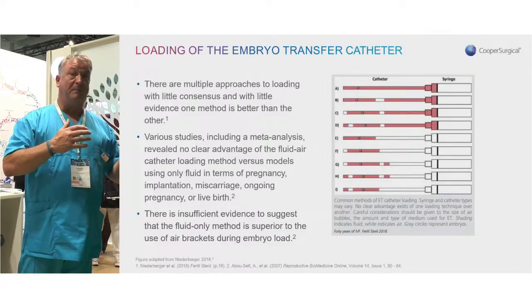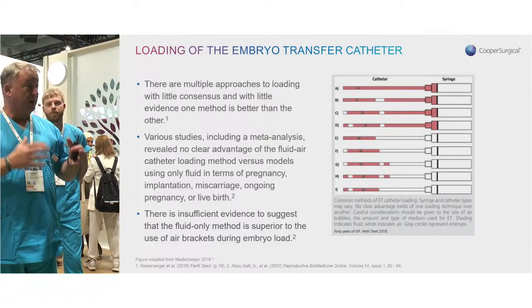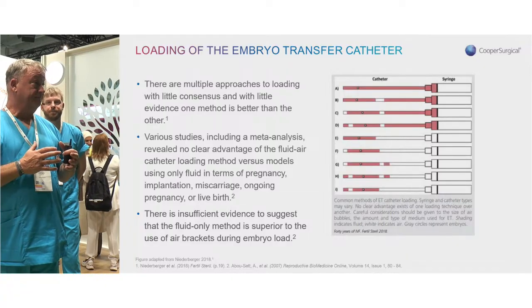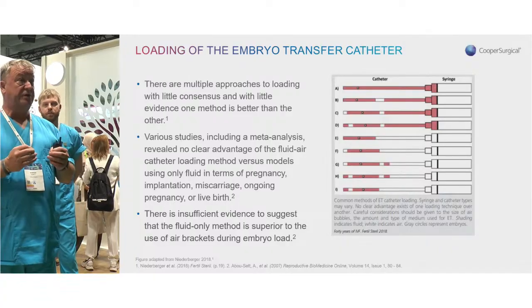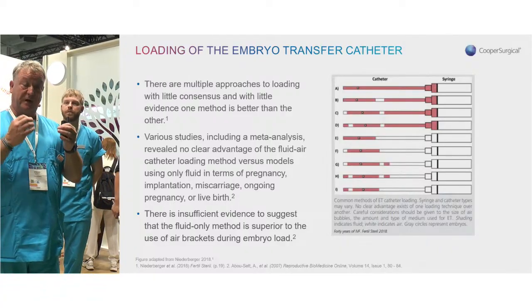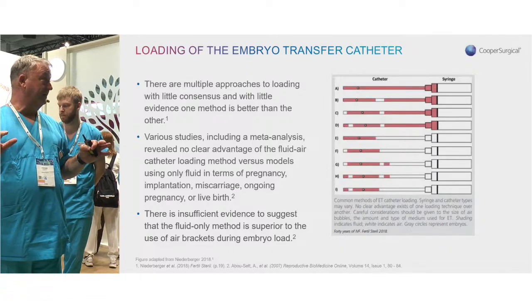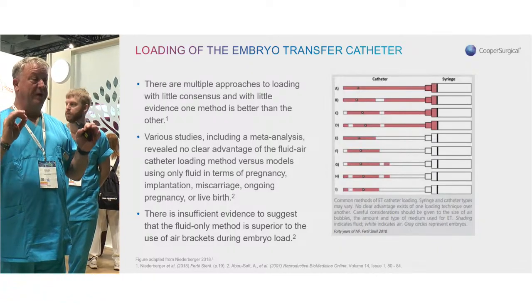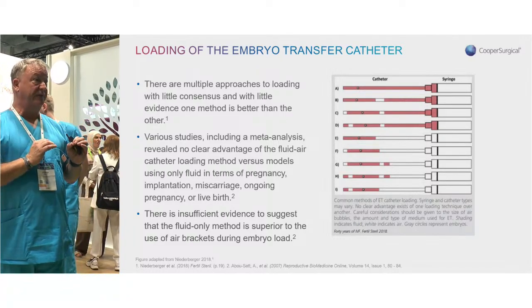We can do double manual witnessing. It has its limitations, but we can also use electronic witnessing, and that will help us maintain chain of custody, give reassurance to the patients, to the clinicians, to the embryologists, nurses, and we can sleep well at night. Okay? That witnessing system gives us the ability to know that everything went as it should.